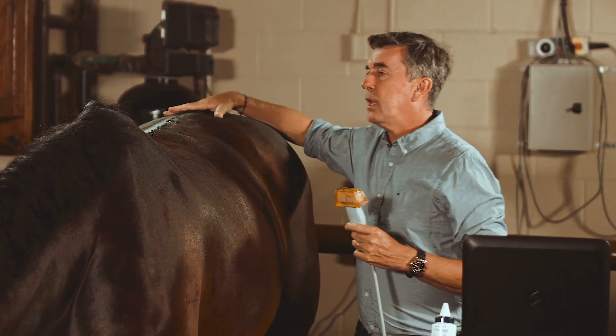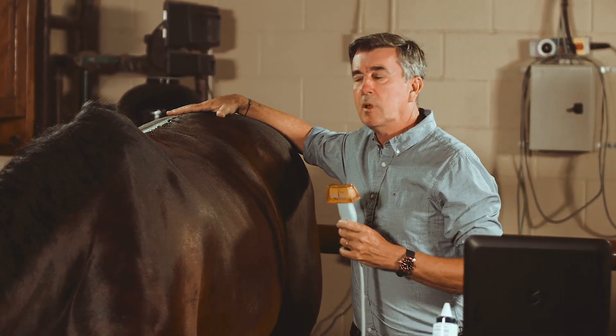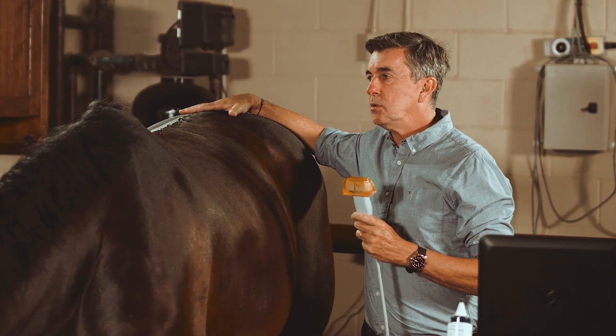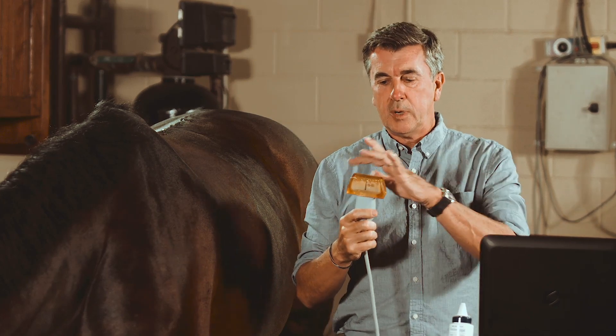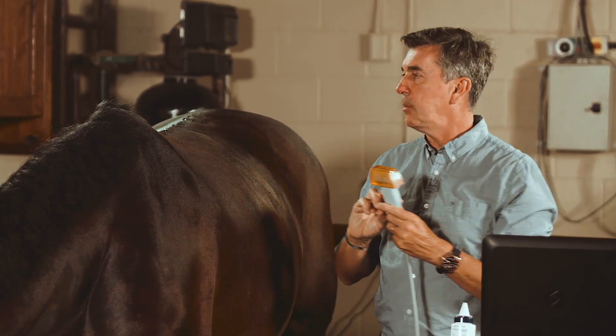With this horse today, we'll try to see most of the important reference images you need to be aware of as you go over the back. We start with a linear probe with a standoff pad in order to evaluate the skin, the fascia, the spinous processes, and the supraspinous ligaments in between.